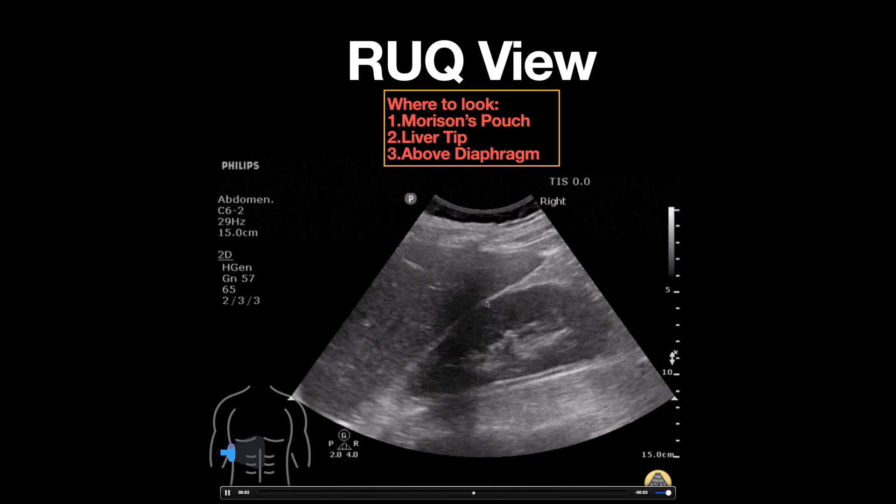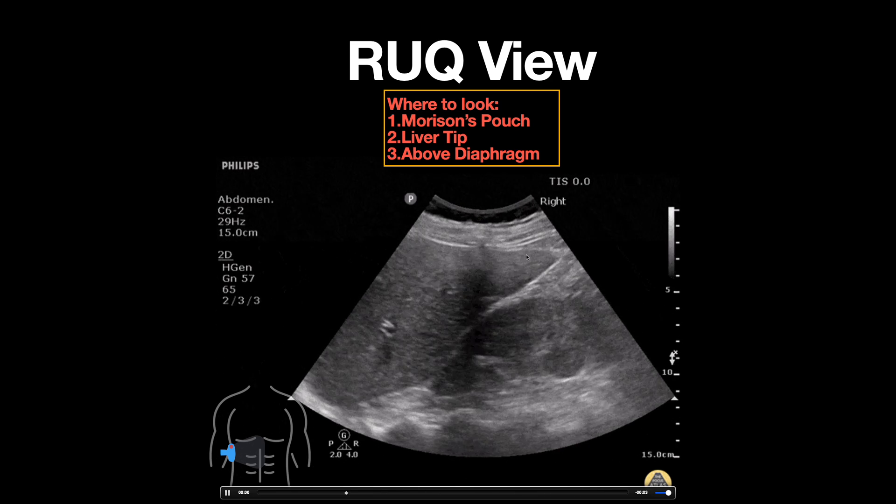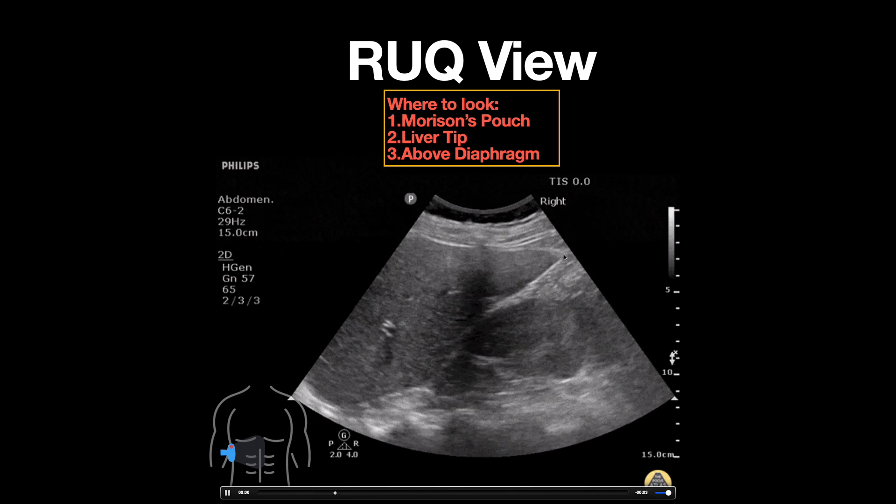but you also want to be looking at the liver tip, which can be seen as this sharp point here. It's important to look here as fluid will often accumulate in this area first.